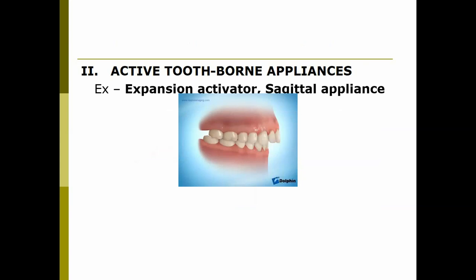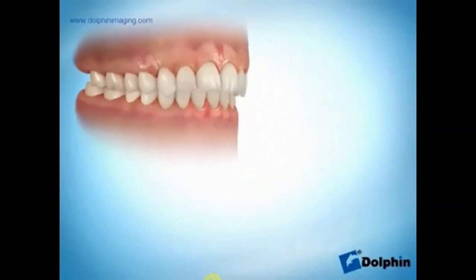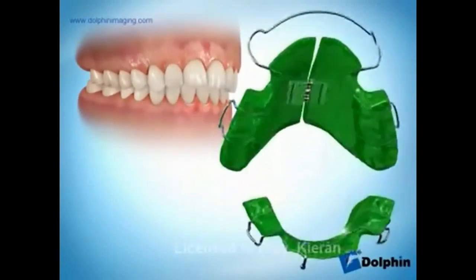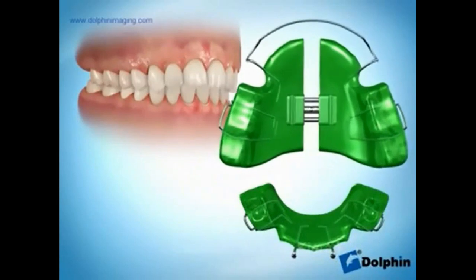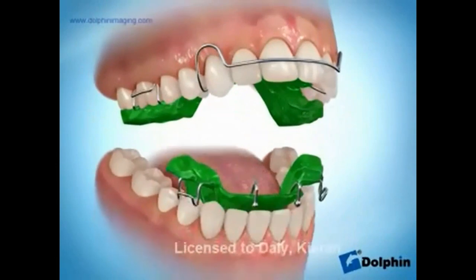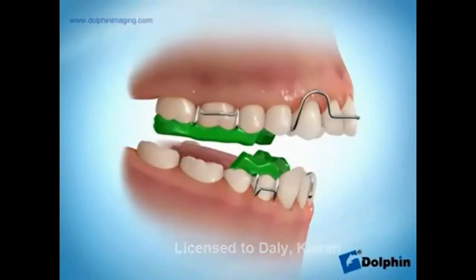Okay. But there are something which is called as active tooth-borne appliances also. That means they will be sitting on the teeth, redirecting the jawbone also, but they will also be actively moving the teeth. So they will have some active component also incorporated, which will be moving the teeth. So if you look at this video, this is actually a twin block appliance. That's why it's in twin. There are two pairs, and you have an expansion screw which is attached in the maxilla. So that expansion screw is going to cause an active tooth movement as well.